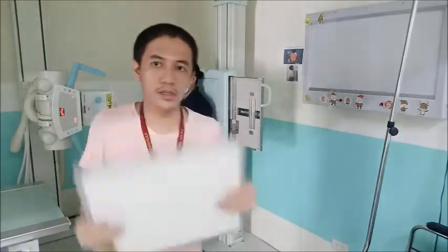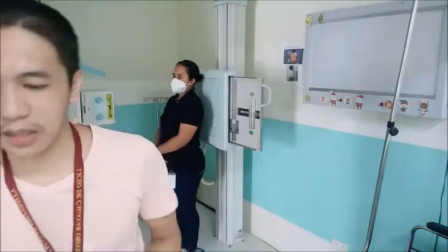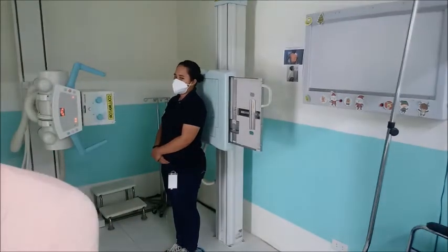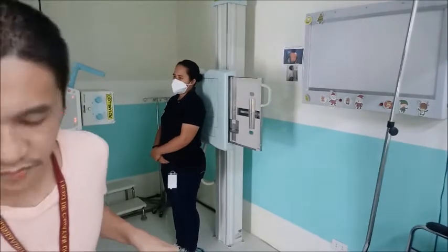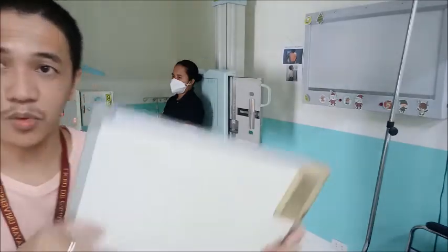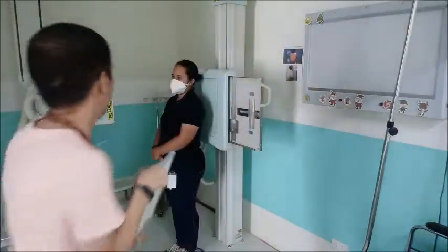So for the apicolordotic view, you can use an 11 by 14 cassette to be safe. Then of course, in order for us to protect the patient from overexposure, the required is a 10 by 12 cassette.